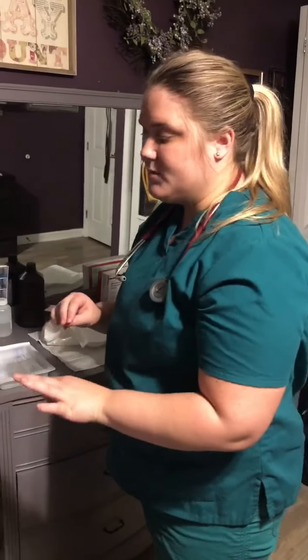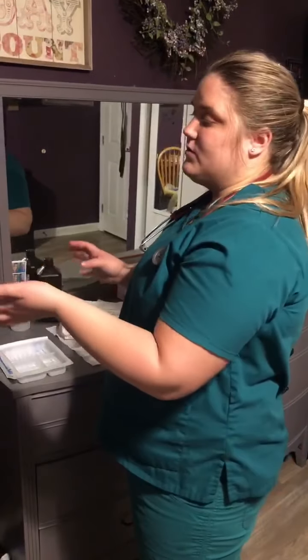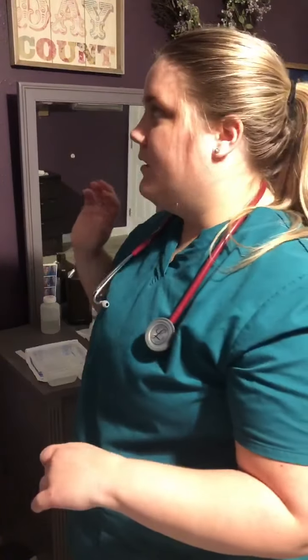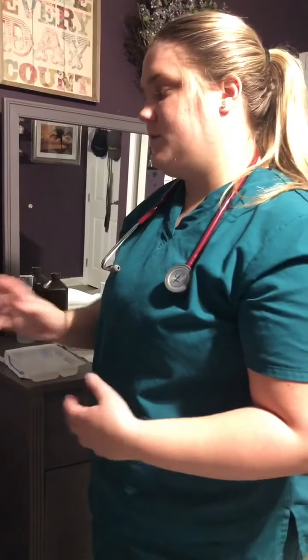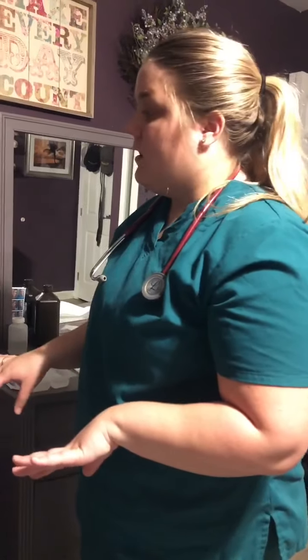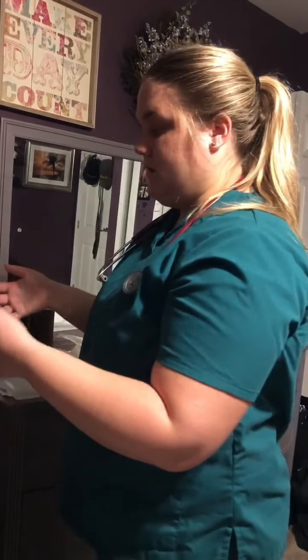And I would document that I performed pre and post respiratory assessment. I would perform the respiratory assessment on them after this was all done, and I would listen to their lung sounds again. I would monitor their pulse ox, take a full set of vital signs, assess their skin color and their respiratory rate and their depth, see if they were comfortable or in any pain. So then I'll document that I had performed the pre and post trach care respiratory assessment.